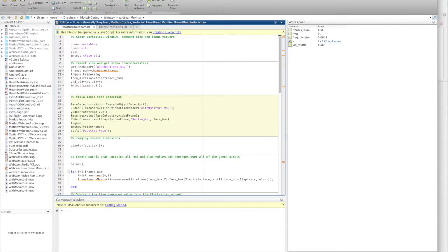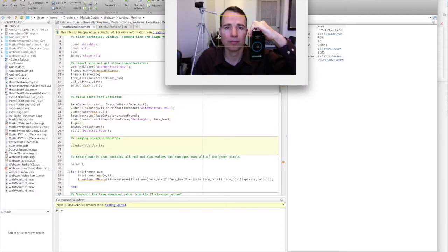face_box returns a row vector with four elements. The first element gives the x-coordinate, the second the y-coordinate, the third is the number of pixels in x, and the fourth is the number of pixels in y. The box is a square, so the third and fourth elements are the same. Let's run in advance. We have successfully created a box on my face.